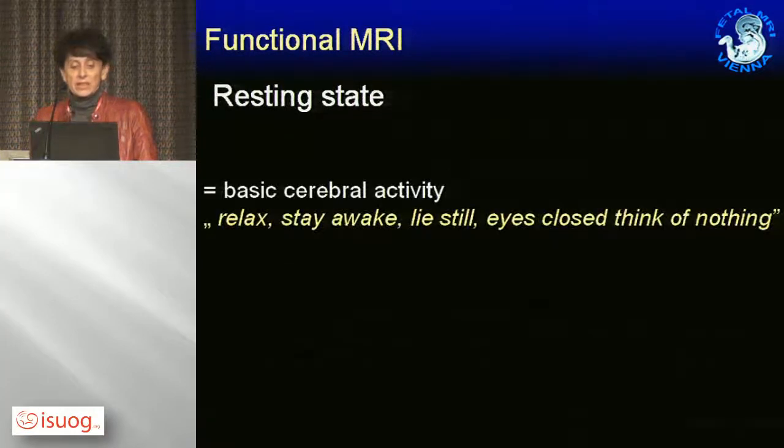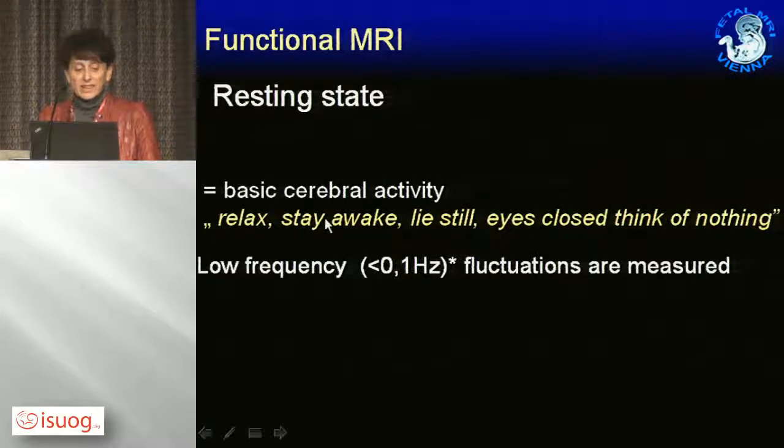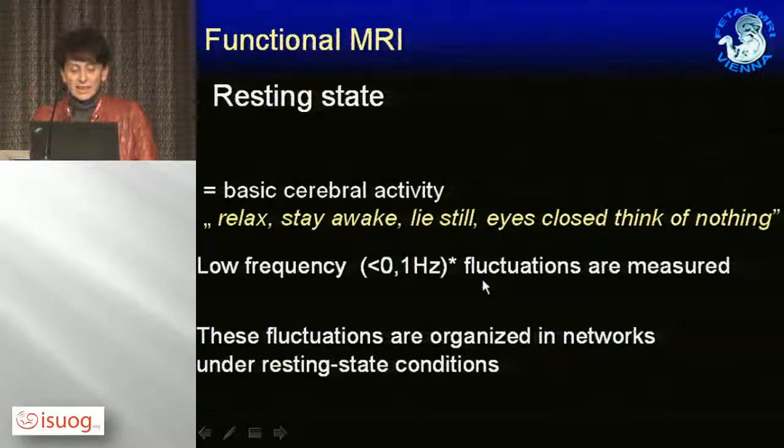What is resting state MRI? It is the basic cerebral activity. Usually we tell the people, relax, stay awake, lie still, eyes closed, think of nothing. Well, it's what you are doing now. Your brain is still working, I can tell you, and we thought it was really a good working place description for a fetus. The facts are that we get low frequency fluctuations, and under resting state conditions, these fluctuations are organized in networks.